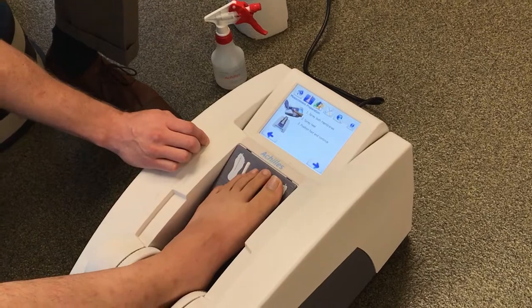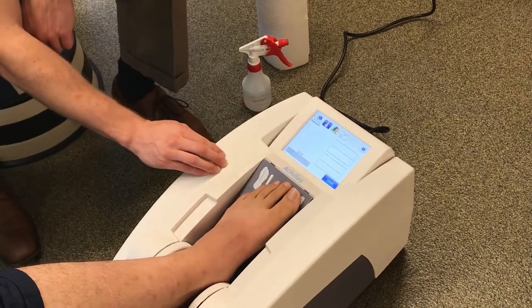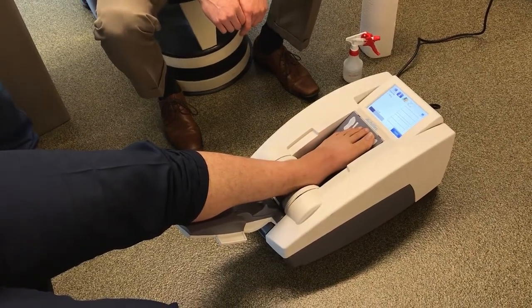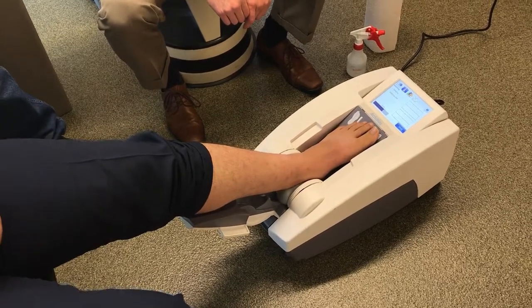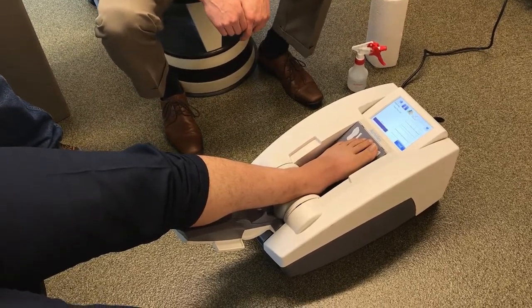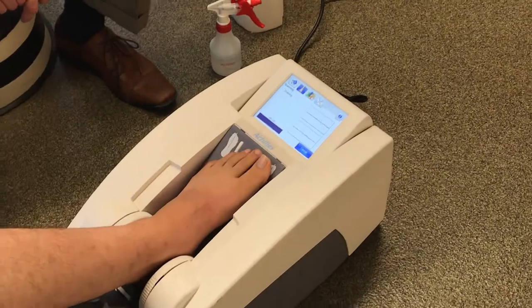It says to spray both membranes — we've done all of that, so we'll go ahead and hit the right arrow button to get it started. Now we'll watch and observe the test. This is where the patient should remain unmoving and not talking. This is a chance to give the patient some information about how the machine works and what this device may mean, which we'll talk about more in a separate video. You can be talking to the patient, but you don't want the patient to be talking. You can see the sine waves that came up on the machine.